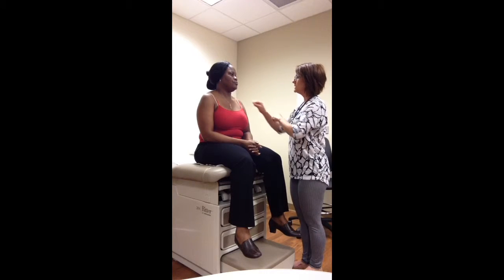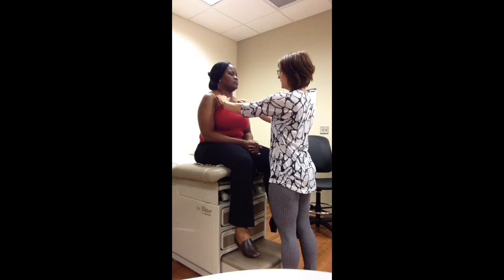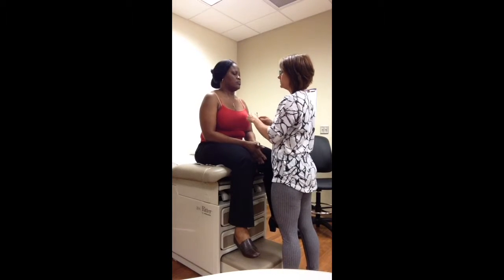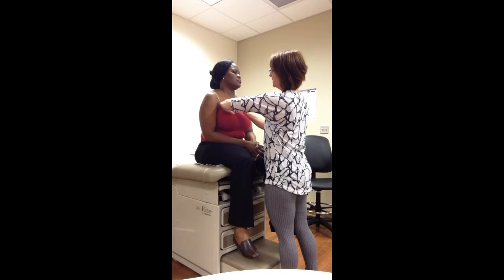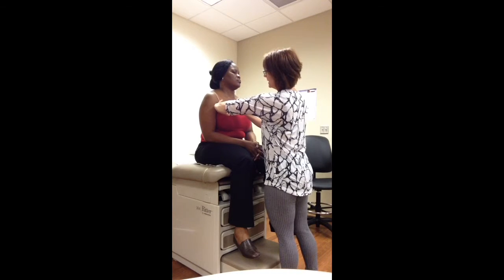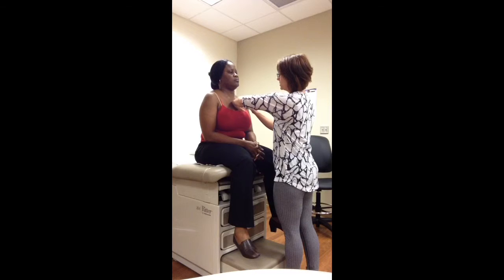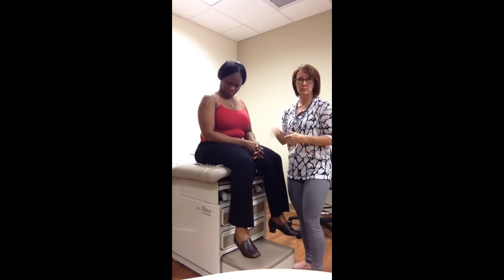And so then again, we're going to do the same thing in the front. So we're going to percuss from the upper lobes. So again, they're up above, about an inch or two above the first rib, above the clavicle into the apex. And you do have to be aware of a person's anatomy. With somebody that has larger breast tissue, you're not really going to be able to percuss or auscultate the lung fields.